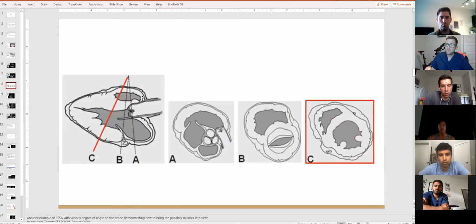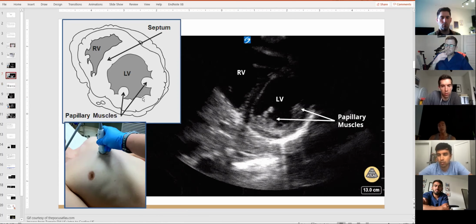Yeah, I had a quick question. When you're trying to do a POCUS and trying to get the parasternal long and short, particularly with patients who are a little bit bigger, if we're not able to get good windows and stuff, do you guys have any tips and tricks on how to try to maneuver that?